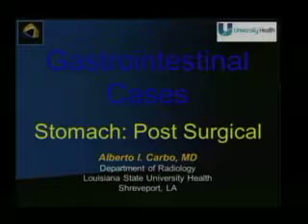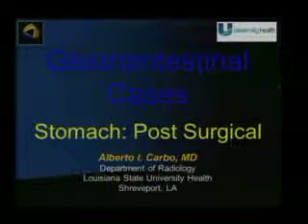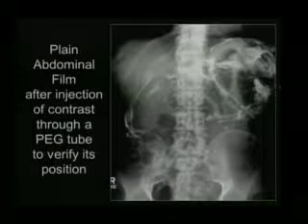So we have been for almost 3 months reviewing the radiology of the stomach. And last time we started to review radiology of the postoperative stomach, and we started with the anti-reflux therapy. It means the gastric fundoplication. So I'm going to review quickly what we saw last time.